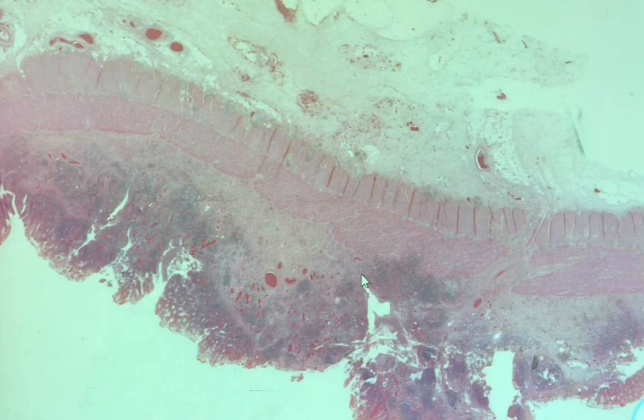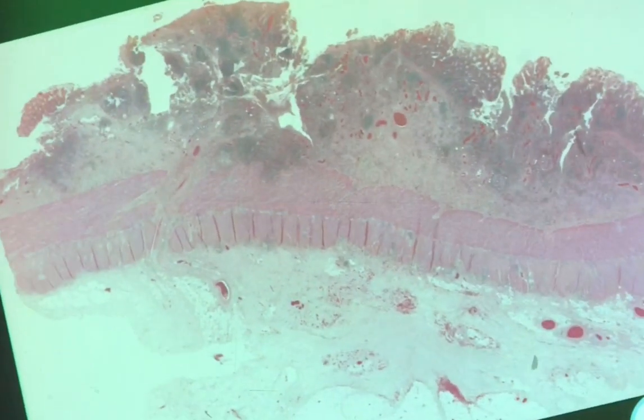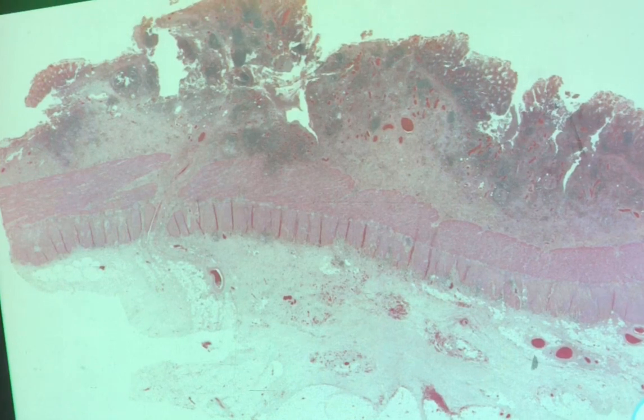A7. And we're just going to rotate this one around too, so it's a little easier to orient. So again, we have surface up here. You have your muscularis mucosae. This is your muscularis propria, and then we're looking into your soft tissue and maybe some serosa down there.